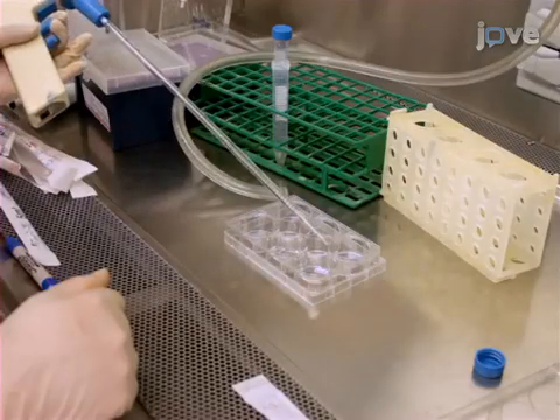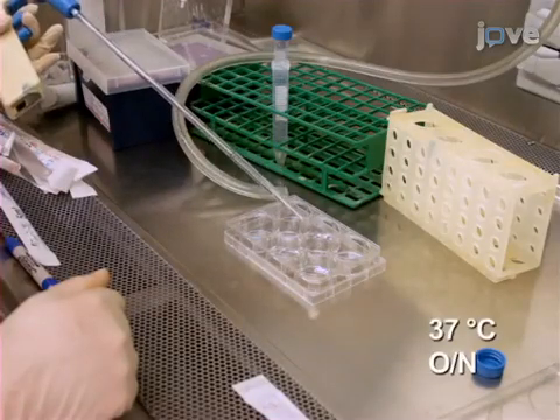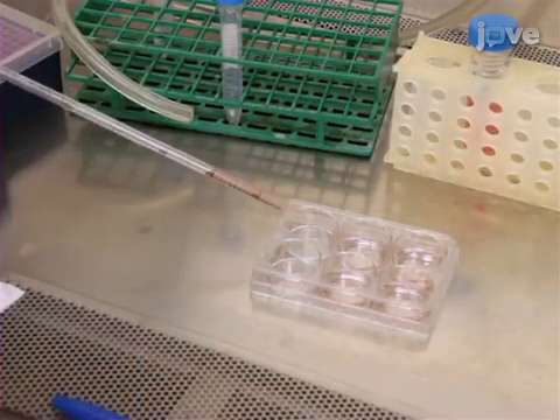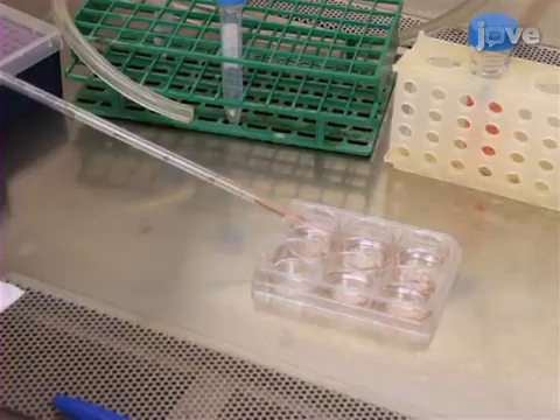Coat the plates with a 0.17 mg per milliliter solution of fibronectin. Then, before the fibronectin dries in the plate, add NCSC culture medium.